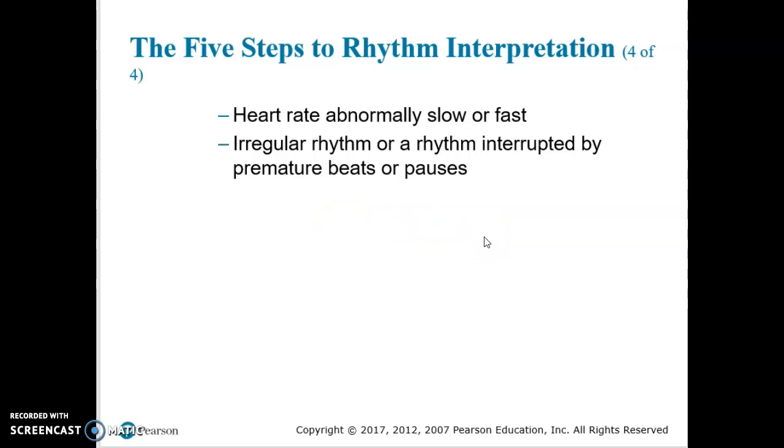And we went over this in one of the previous chapters. And arrhythmias are considered abnormal heart rhythms. Tachycardia is considered a heart rate greater than 100, where bradycardia is considered a heart rate less than 60. And normal heart rhythms should have P waves that are upright, matching, and precede the QRS complex.